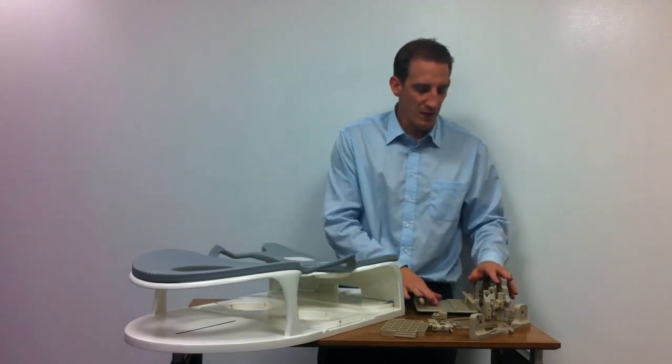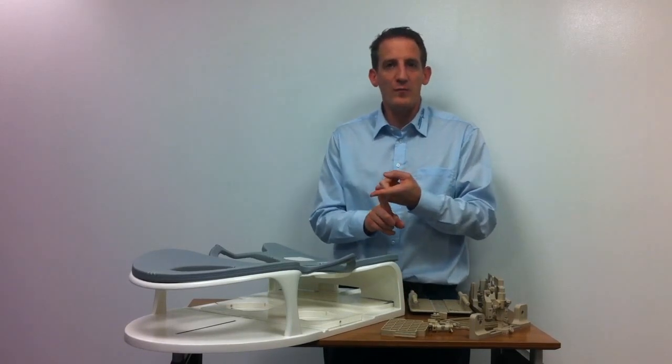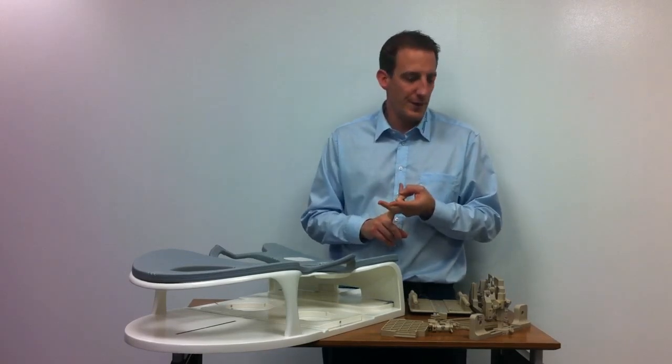Over here is our biopsy unit itself. We have two options: one is the post and pillar positioning system, and the other one is the grid localization system using the regular Norris grid.